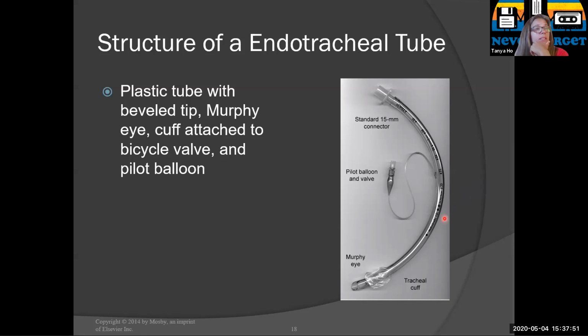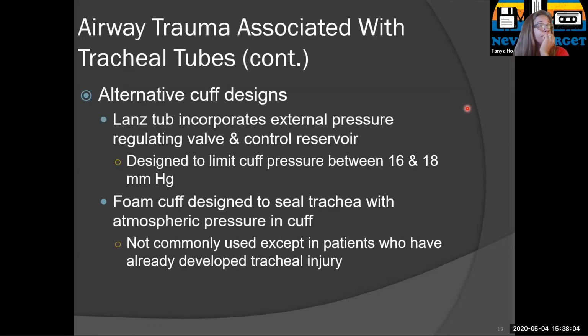The other thing is the tube will mark what size it is, okay? So you need to be able to identify that on an endotracheal tube, like what size it is and the markings and all of that.